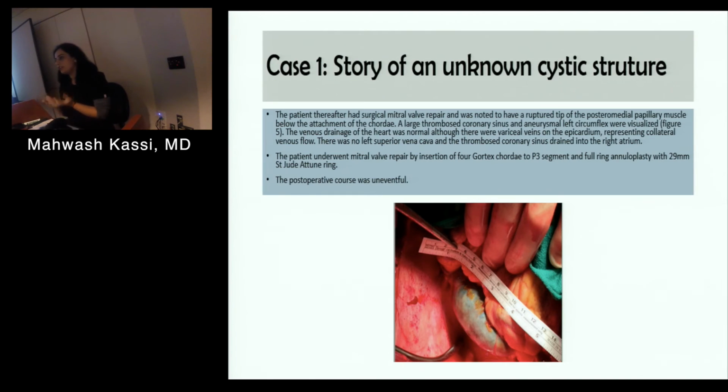But if you have a dilated coronary sinus, you would think that there will be areas of stasis, right? Even if you have an AV fistula, it's dilated because of increased flow. Right. But I wonder if what happened is that it became dilated and then once the circumflex occluded, you get this big aneurysmal coronary sinus with a low flow state. Yeah, I'm not convinced one way or the other. I'm just trying to say that these are hypotheses one could work around.